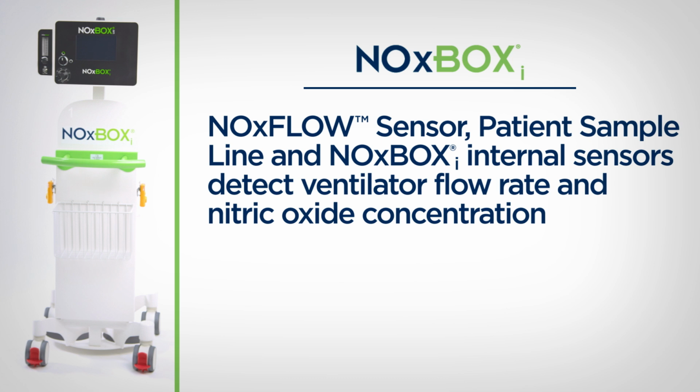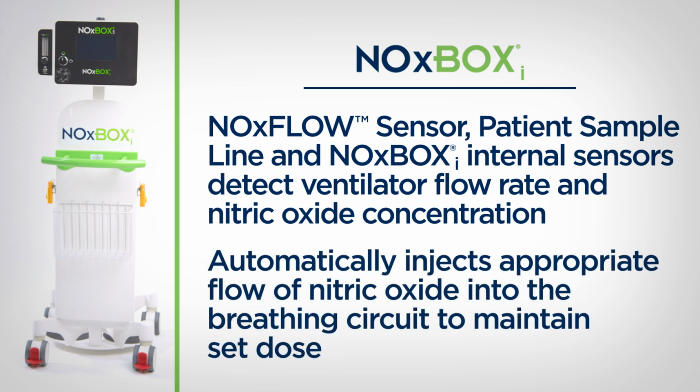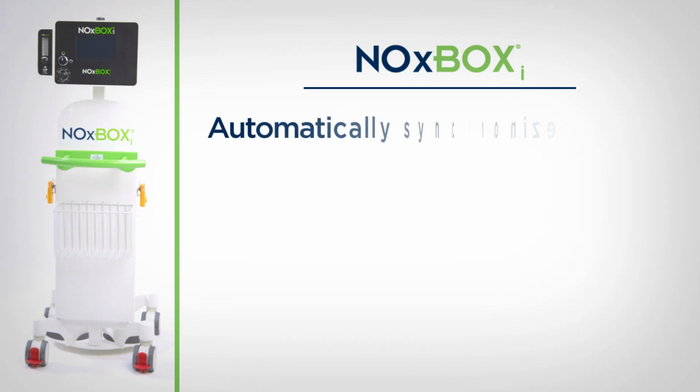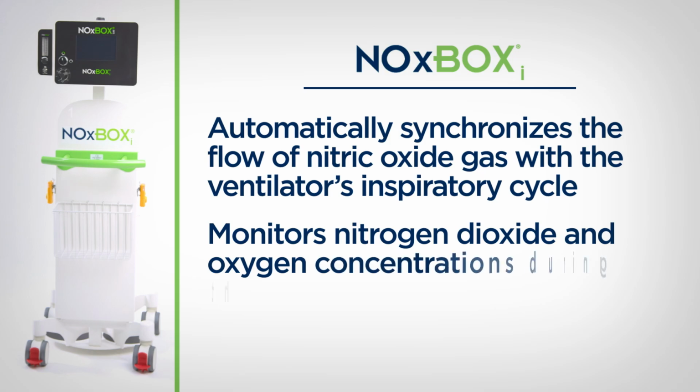The NOxBOXi system then automatically injects the appropriate flow of nitric oxide gas into the ventilator breathing circuit to maintain the set dose of nitric oxide therapy. The delivery of this dose is automatically synchronized with the inspiratory cycle of the ventilator. Nitrogen dioxide and oxygen concentrations are also monitored by the NOxBOXi system to ensure appropriate levels during therapy.